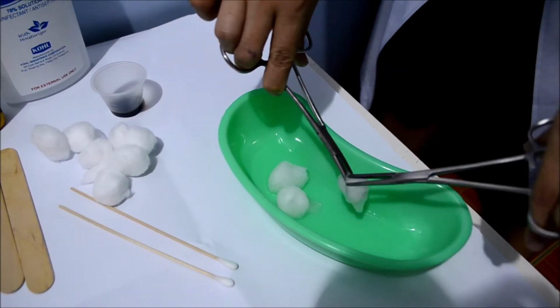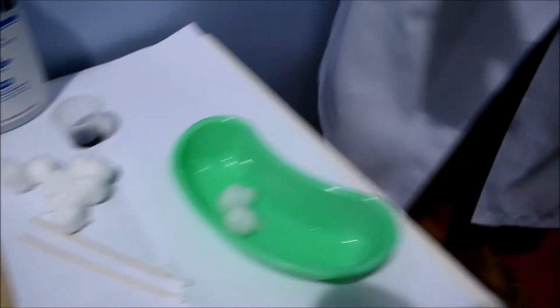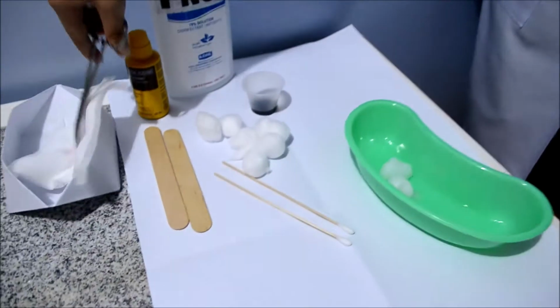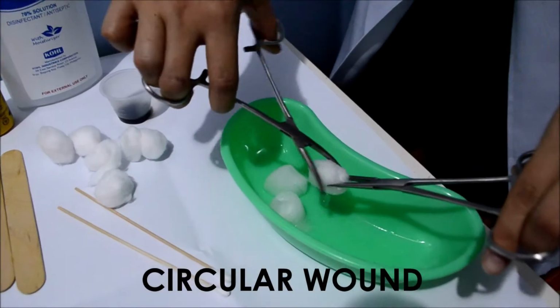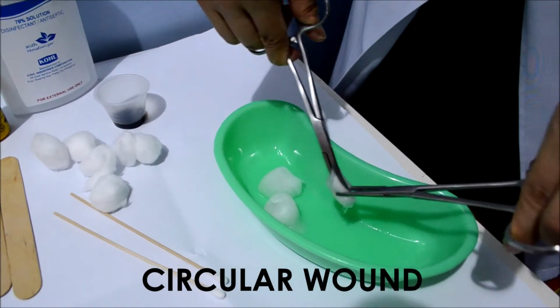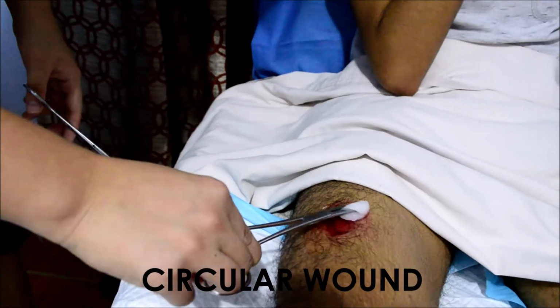If the gauze adheres to the wound, loosen the gauze by moistening it with sterile normal saline solution by using the cotton balls. Get the pick up forceps in the dressing set with the left hand and pick up the cotton balls in the kidney basin and gently dip into the PNSS to cleanse the wound.